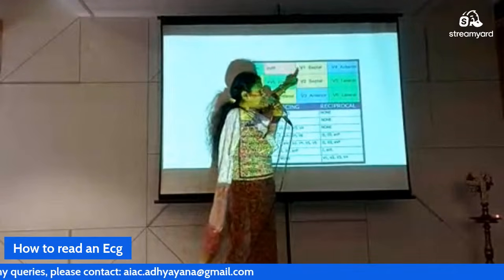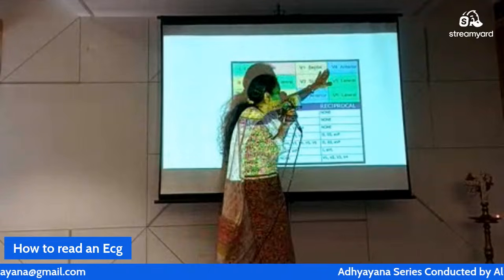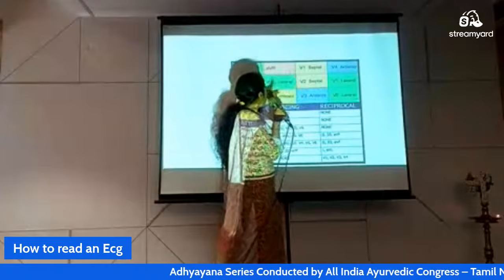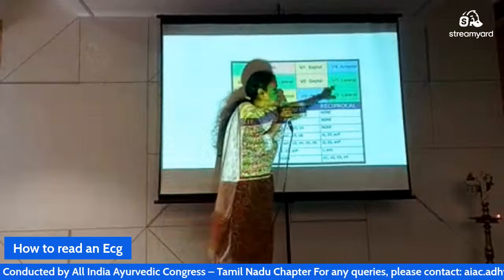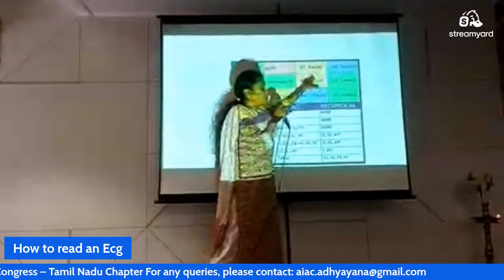And if you get ST segment elevation in V1, V2, V3, 4, it is anterior septal MI. And V5 and V6, also lead 1, aVL, V5, V6, it is a lateral wall MI. Okay? They have all green shades, yellow shades, or blue shades, and these.